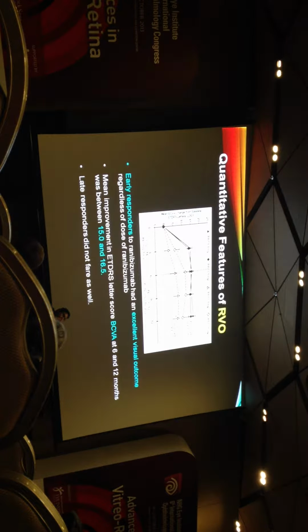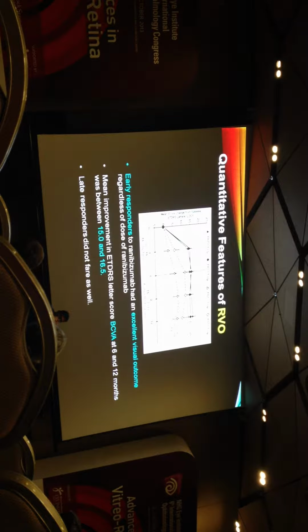And also, before I forget, as Dr. Sada mentioned, when we talk about the central subfield thickness, it's important to remember which OCT device you're using. You can't compare between, say, a time domain OCT used previously and a spectral domain OCT that you just brought into your clinic, because even if we measure the same patient, same day, same time, using different machines, inherently you're going to find a difference because of the segmentation algorithms. And of course, there's the issue of segmentation errors, as well as the plain measurement differences.